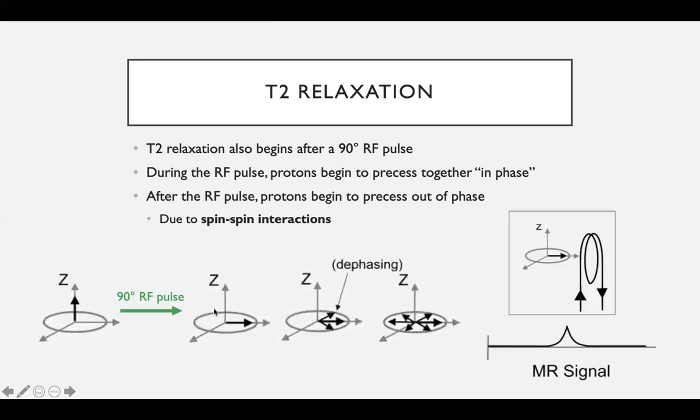So if we look at this point in time, all of our magnetic vectors are in the positive y-axis here, or the xy axis. And once you remove that energy, they will start to equilibrate, and they will have a 0 transverse axis component. And you might be thinking, how do we measure the amount of magnetism? And how we do this is we have a coil that is perpendicular to our magnetic vector of interest, so the transverse axis in this example.